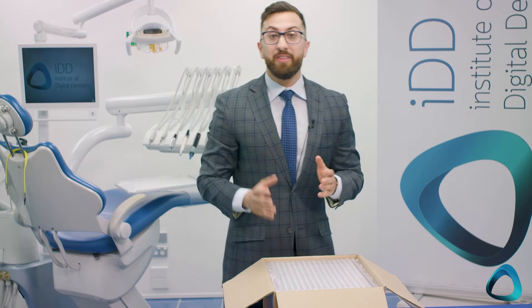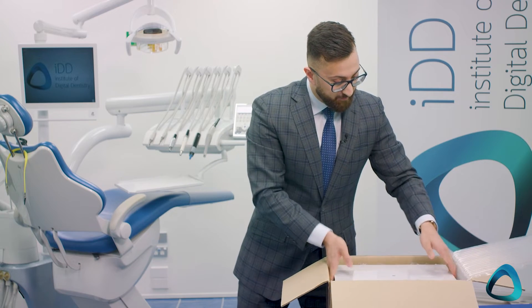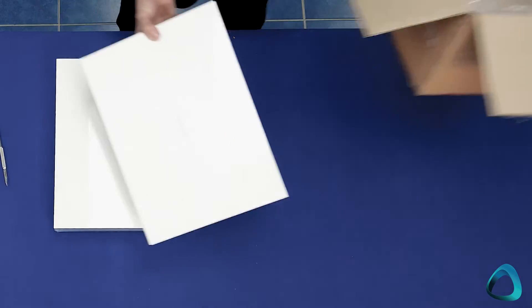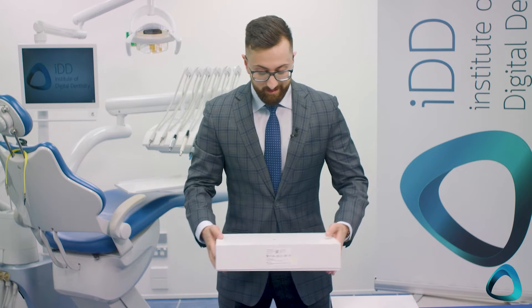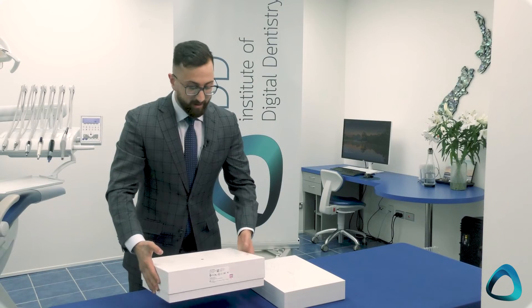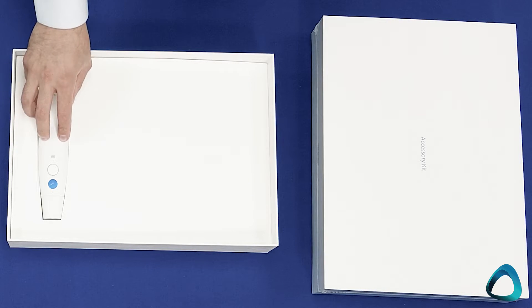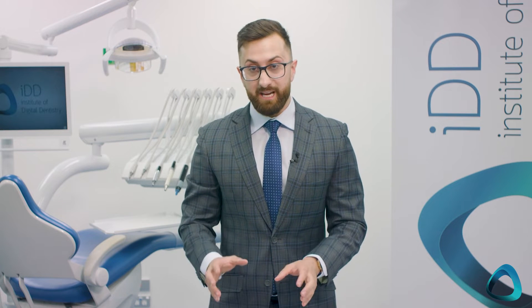For those of you who have seen our other Medit unboxing videos, you know these are quite tightly packaged boxes. The Medit i700 wireless comes with two boxes — the scanner box and the accessory kit — and somewhere in here we expect to see the battery pack and the wireless scanner. The packaging is the same presentation as the Medit i700. We have the scanner and the Medit quote about 'scanning reimagined' — a really high quality presentation.